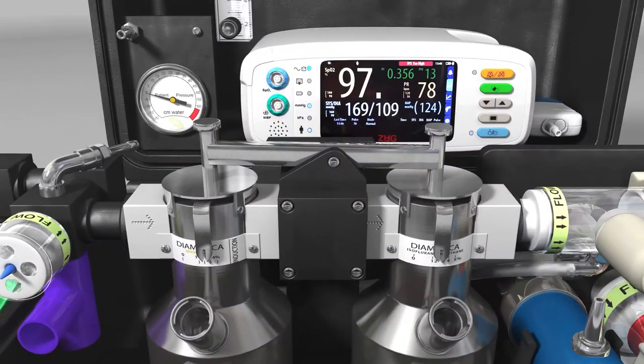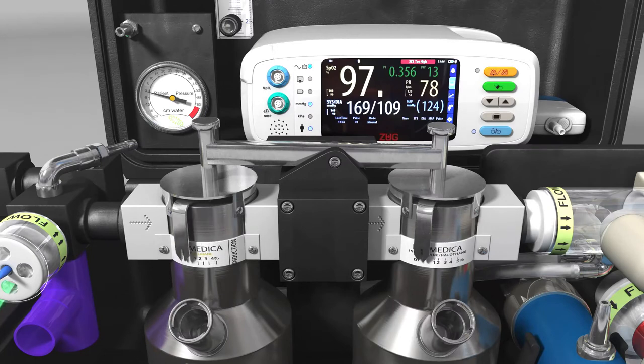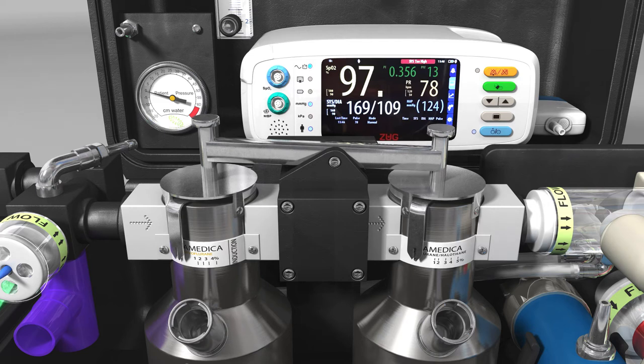To select a vaporiser, first set both vaporisers to zero, then to select which vaporiser you require, push down on the opposite pivot arm. Once selected, the vaporiser lever should move freely.